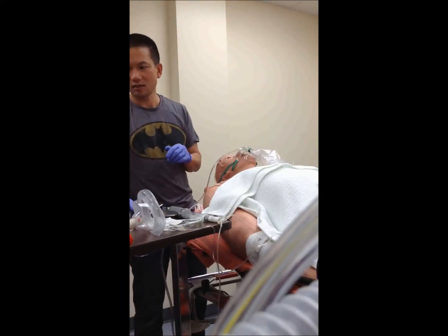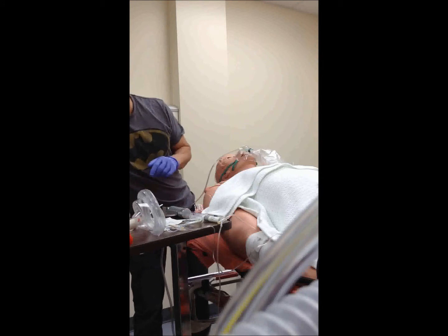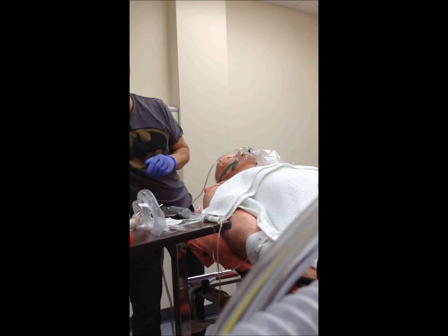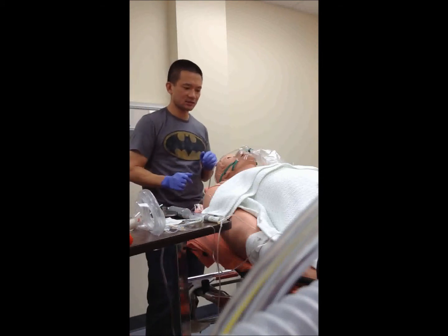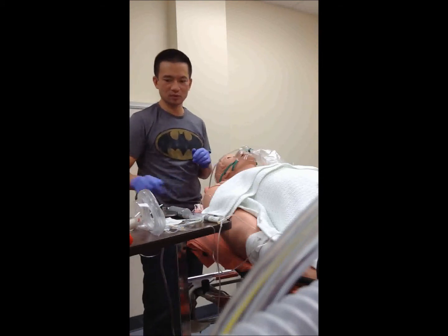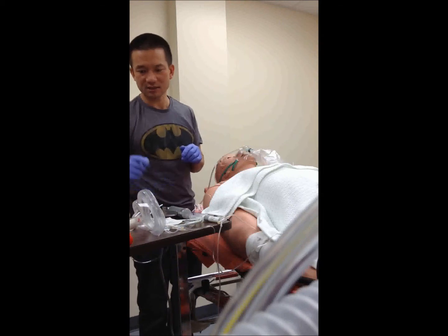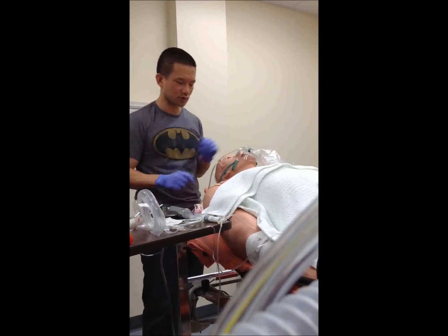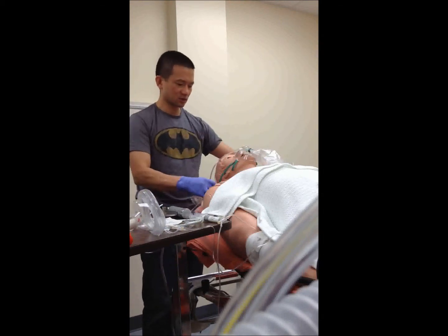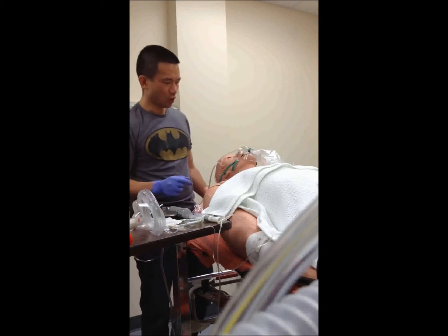And we've got our surgical airway ready as well. That's S. T is for tube — we have a couple of different sizes: 7, 8, and 9. T also for tube tie.